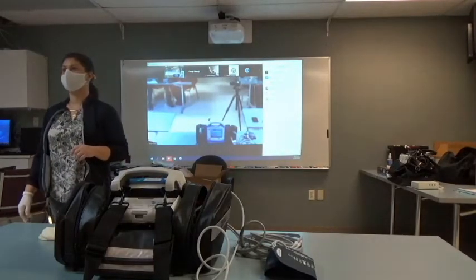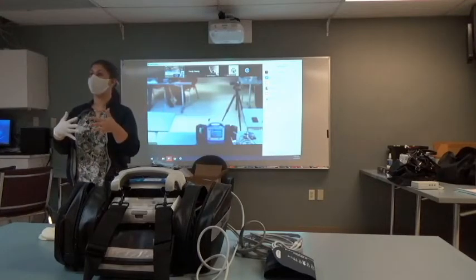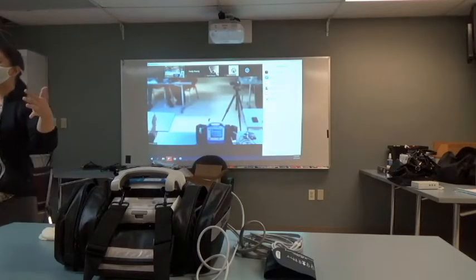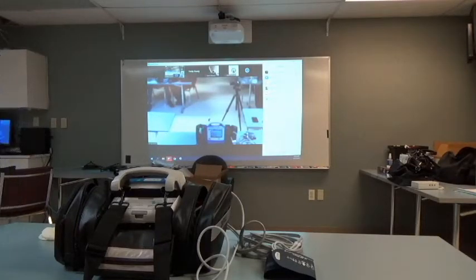What's smart cuff? Smart cuff is where we're syncing to the R wave. That's a great question. That's where we're syncing to the R wave with the four lead, where it says, okay, I hear a beat here, here, here. I'm going to ignore the noise in the background to help you out. Does that answer your question?